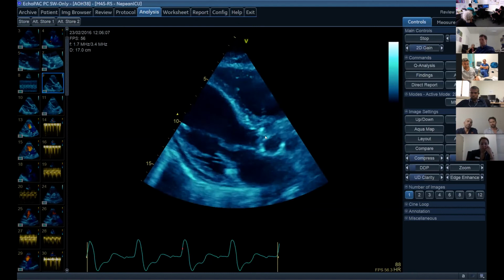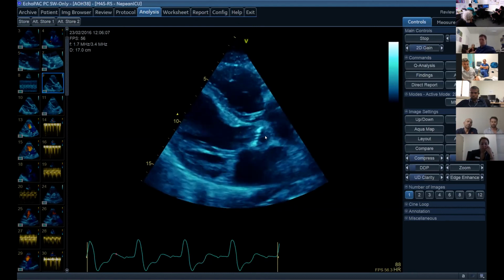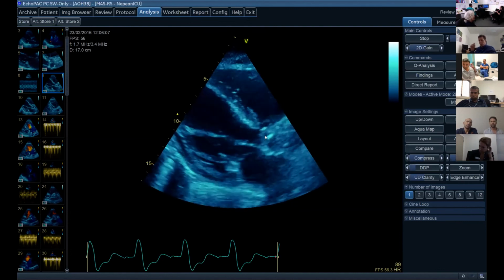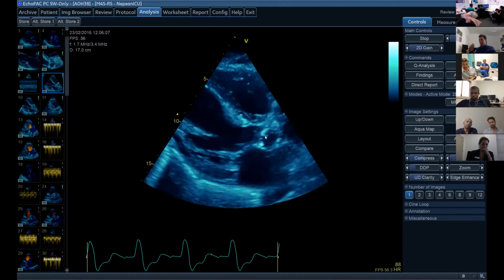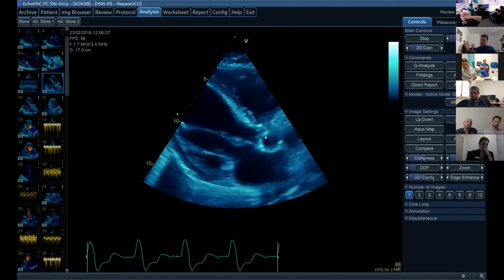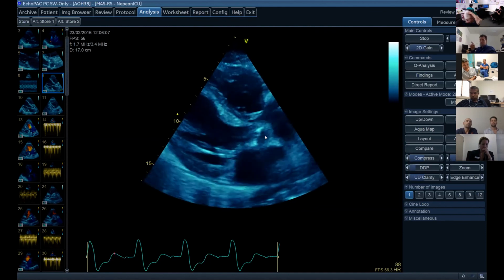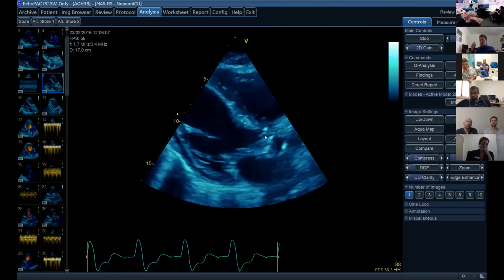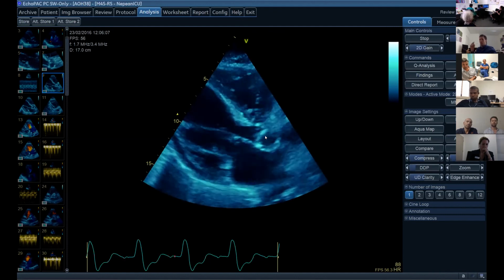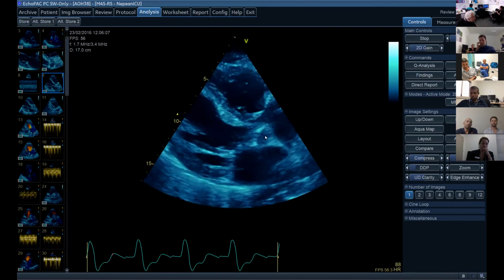Yeah, I completely agree. So maybe just in summary to wrap it up at the end, when you're talking about aortic stenosis, you've got to know the advantages and the disadvantages of every single marker. We obviously love asking about this because if you get this, you get echo and you understand the nuances of it, because sometimes the parameters don't match up, and that's where you've got to take in that idea of seeing the whole heart. And yeah, we're going to ask you about this in some way, to be honest, in the exam.